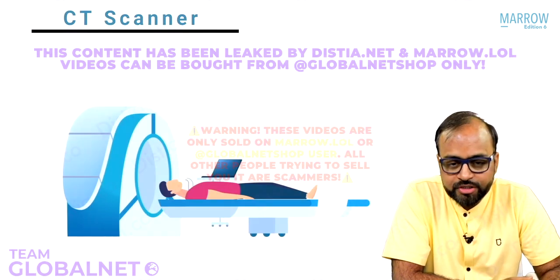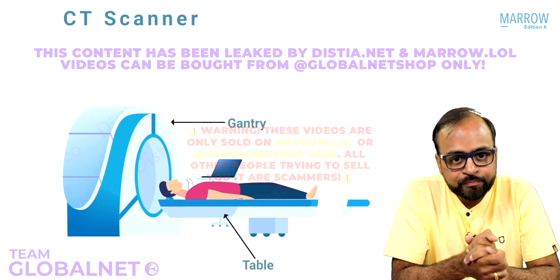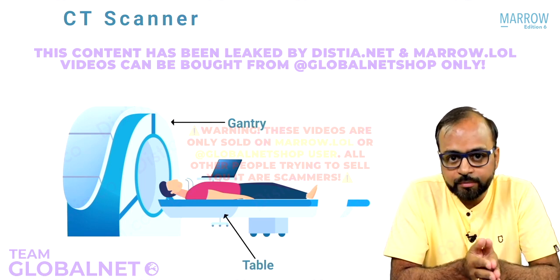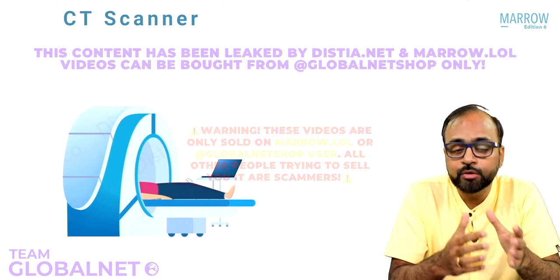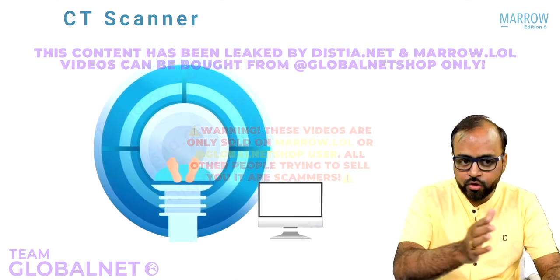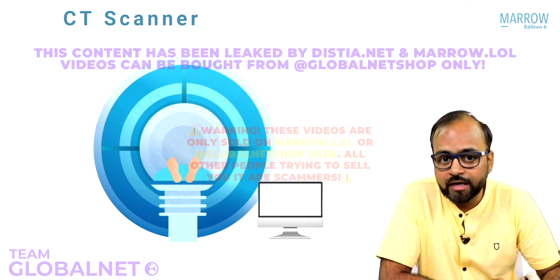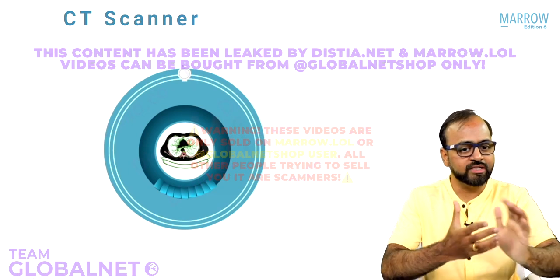Now, how does a CT scan machine actually work? See, this is how a CT machine looks like. It consists of a gantry and a table, and a patient whose CT scan is to be done is lying on the table of the CT scan machine. Now this table gradually slides into the bore of the CT scan machine, and that is when a CT scan actually begins. Now just imagine that this patient has gone inside this particular gantry. What happens inside now? Let us open up the CT scan gantry and see what is there inside it.